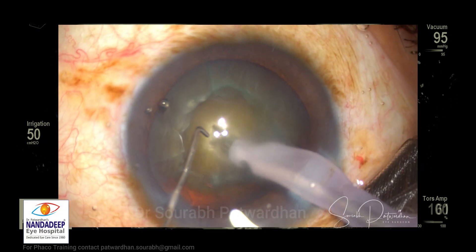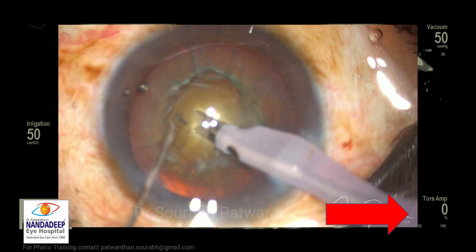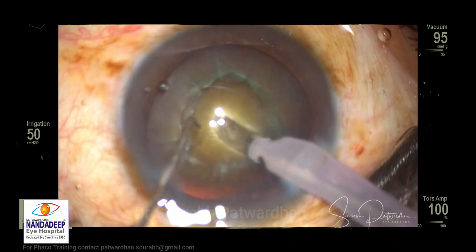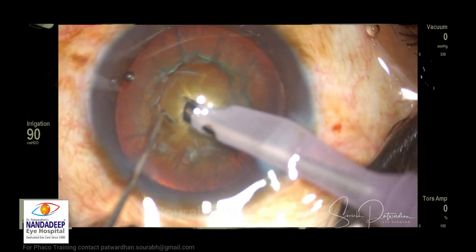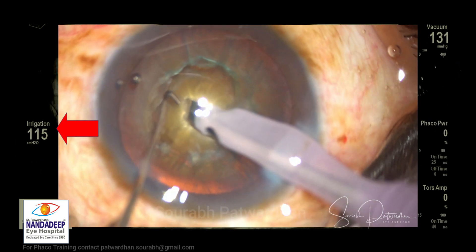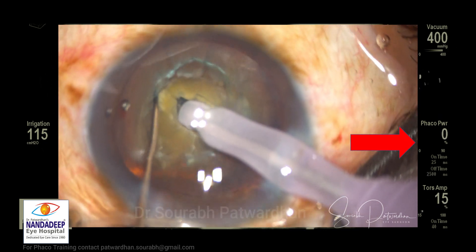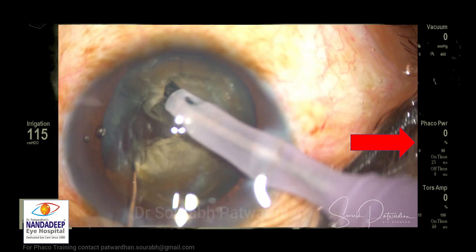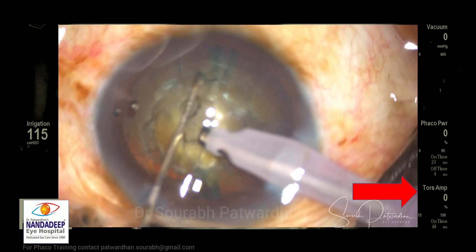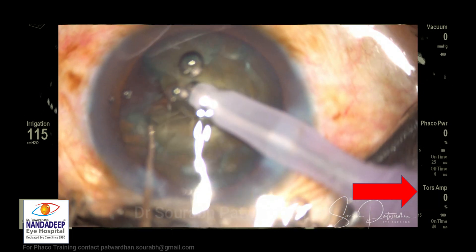I am now doing trenching. You can see I am using 100% Ozil, avoiding any push on the nucleus, using full power and making a good deep half trench followed by chop. For the chop, I have raised the IOP to 115 centimeters. I have also added the longitudinal FACO power, which is set with 25 millisecond burst and 90% power, while torsional is set at 100% with 40 millisecond burst.